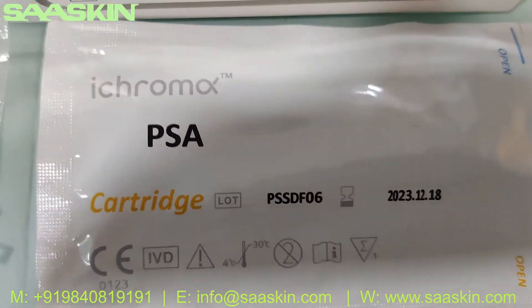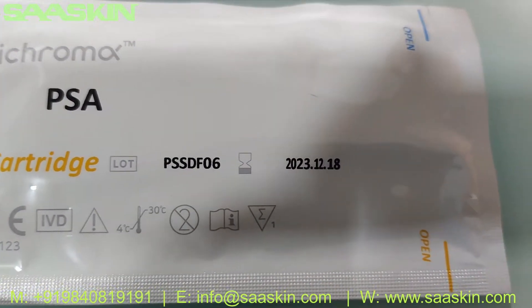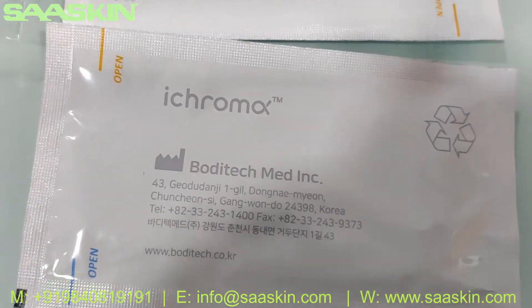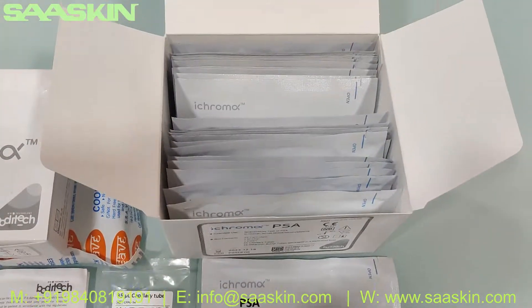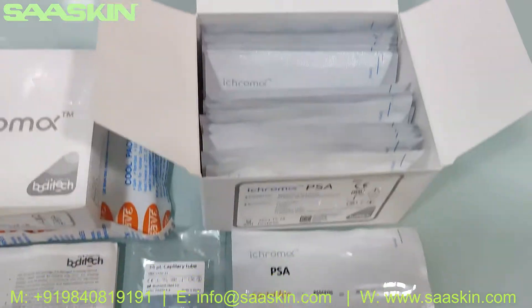You can see this is the cartridge — the ICHROMAX PSA cartridge. You can see the expiry date on it. This is the other side of the cartridge. You have 25 cartridges in total, and I also want to show you the ID chip.